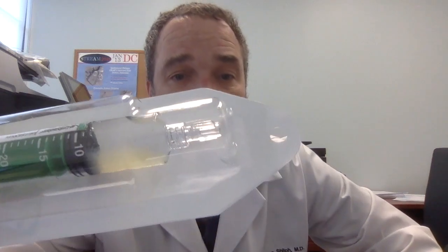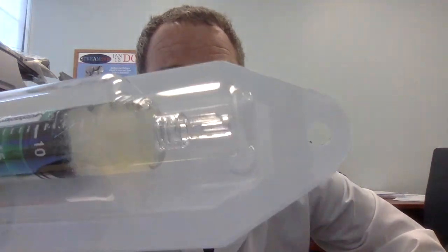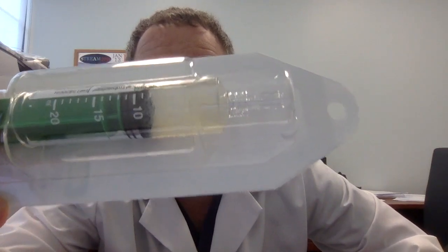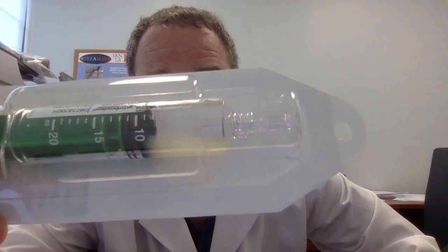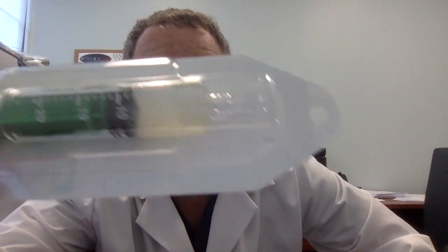Another product that's used very commonly are these particles, and I'm going to shake them up a little bit. You can see them spinning around. They're made of plastic, they're inert, and they go in the body, and they also block off blood vessels. This is often used for tumors and may have been used, in fact, in Mrs. Trump's case to block off the blood flow to the benign tumor of the kidney that she had.